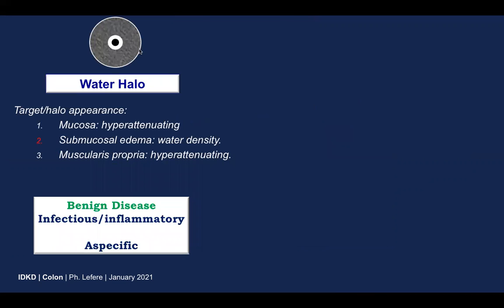The first zone presents with the typical water halo sign. This is the advantage of using water instead of positive contrast, because water allows you to see three different layers: the central mucosa, which is hyper-attenuating; then the submucosal edema, which has water density; and finally, the muscularis propria as a slightly hyper-attenuating thin layer. This corresponds to benign disease — infectious or inflammatory — and is aspecific for benign disease.